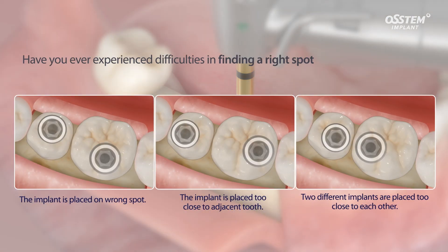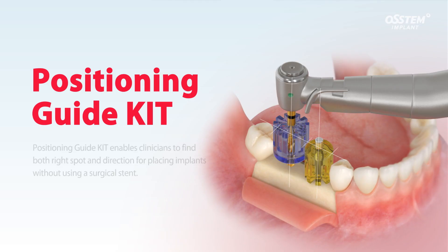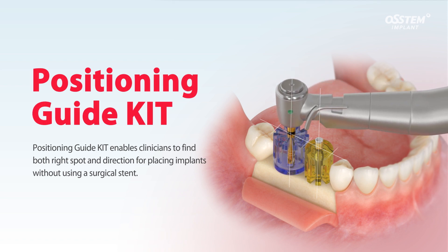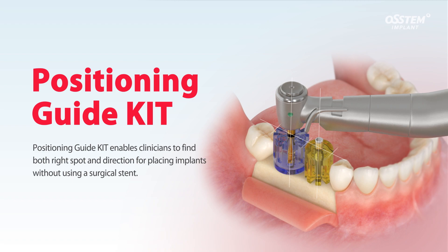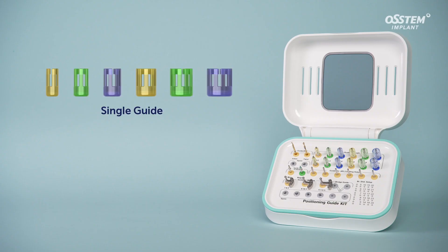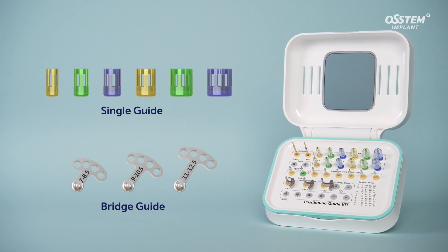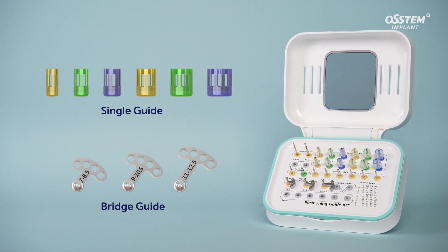Have you ever experienced difficulties in finding the right spot for implant placement? Positioning Guide Kit enables clinicians to find both the right spot and direction for placing an implant without using a surgical stent. It contains both single guides and bridge guides so clinicians are able to deal with different clinical cases.